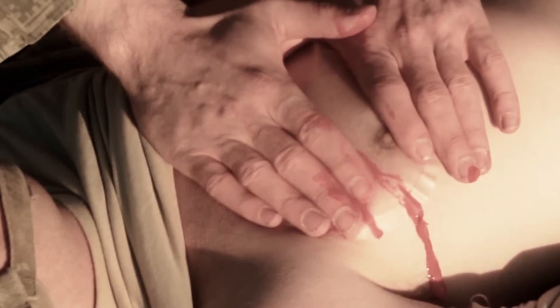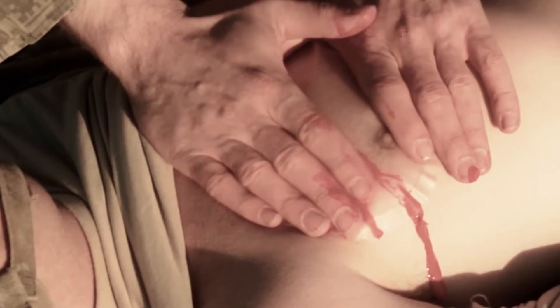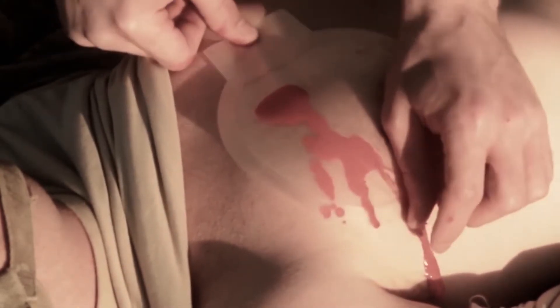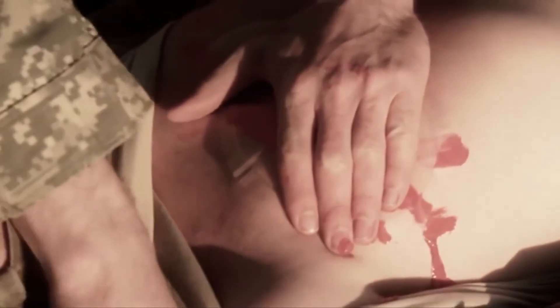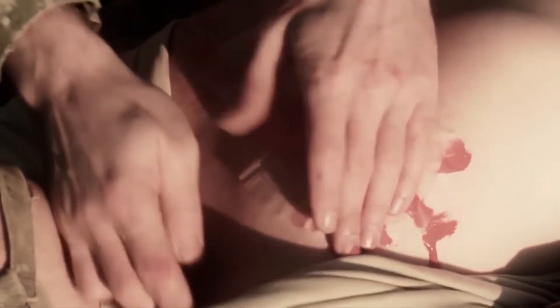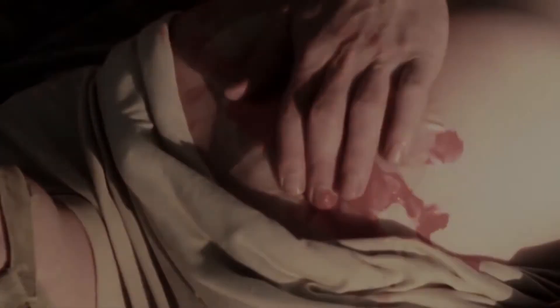Next you will want to seal the wound. Since air can pass through most dressings and bandages, you must seal the open chest wound with plastic, cellophane, or other non-porous airtight material to prevent air from entering the chest and collapsing the lung. We will demonstrate how to use a chest seal. The edges of the sealing material should extend at least two inches beyond the edges of the wound. Have the casualty exhale — tell the casualty to breathe out and hold their breath. This forces some of the air out of the chest wound. The more air that can be forced out before the wound is sealed, the better the casualty will be able to breathe after the wound is sealed. Apply the sealing material over the wound.